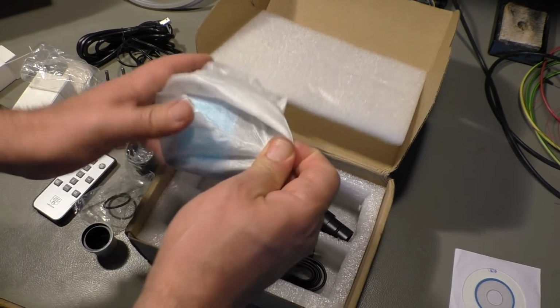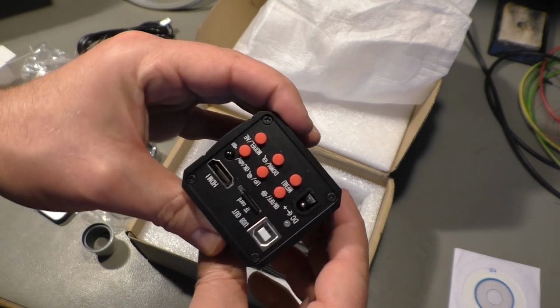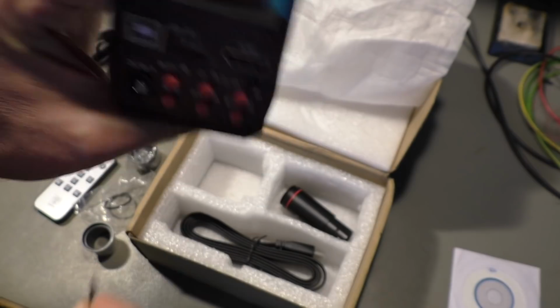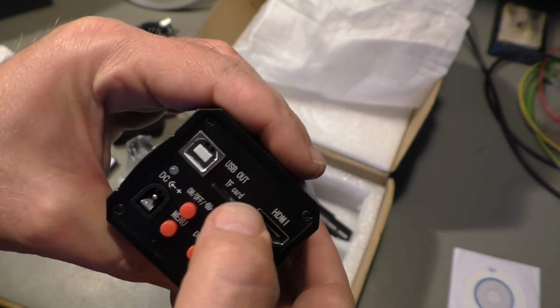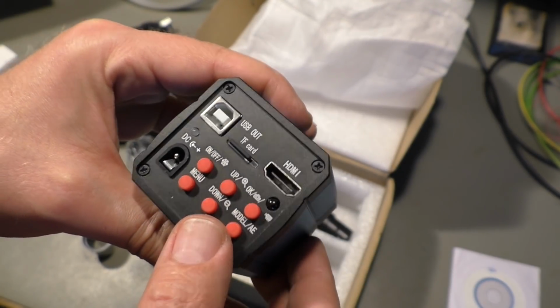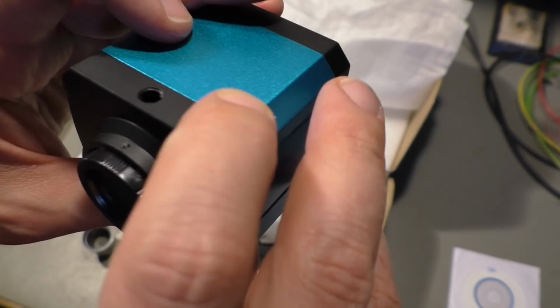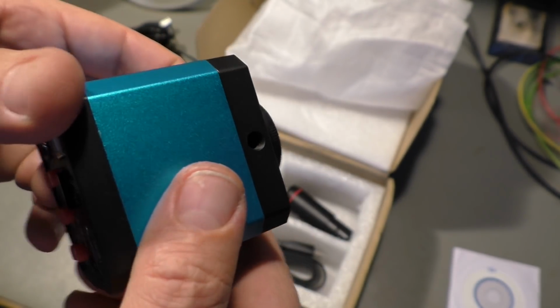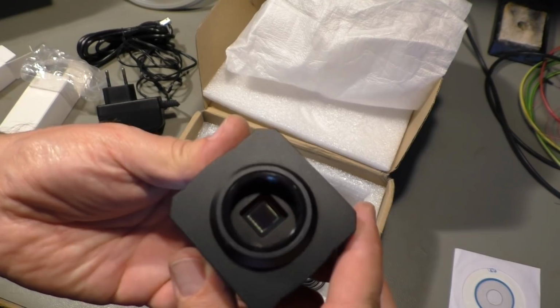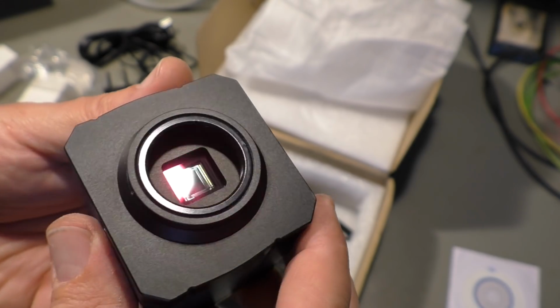And of course we have the camera itself. It has a lot of buttons, a TF card, normally there is no card with it, so I already installed one. An HDMI port, that is important to know because you need an HDMI monitor to make that camera properly work. And of course there's another cover that protects the sensor inside. They say it's a Panasonic chip.